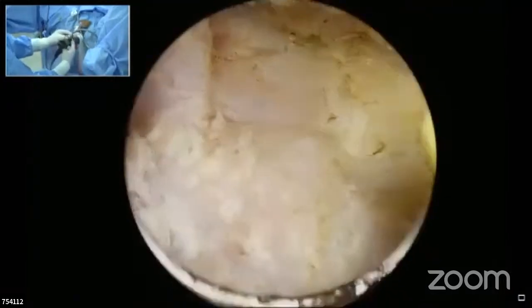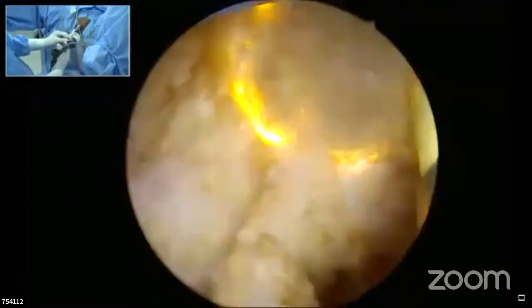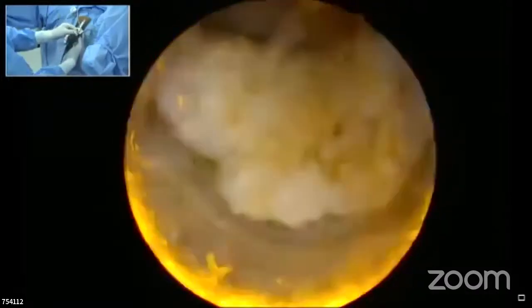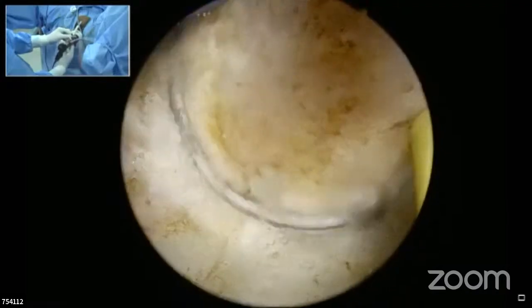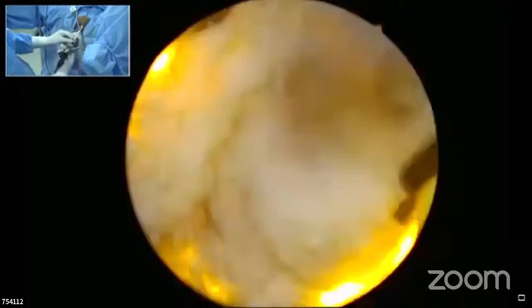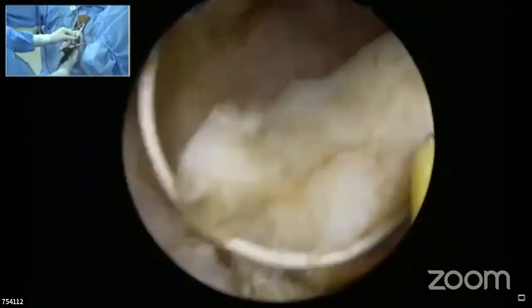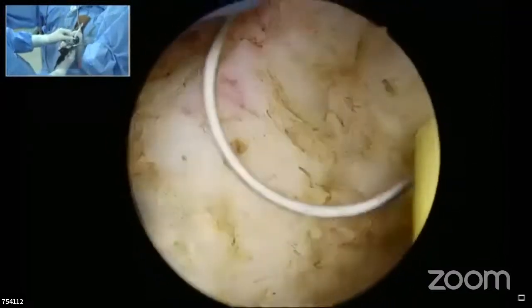The main point of caution for someone trying to start this technique would be not to breach the capsule upfront. One of the major limitations is that we target the capsule upfront. So we should not be causing a perforation in the initial few minutes. That would derail the procedure in a big way. Absolutely, that's the trick. You stay short of the capsule, with good control of the vasculature.